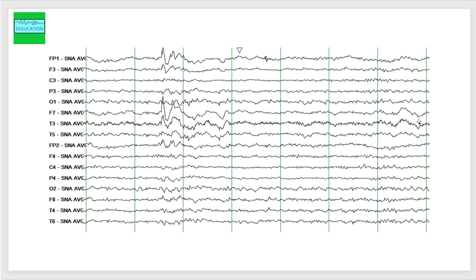When you see asymmetric slowing and sharp waves in one hemisphere, in your EEG report, you can say that this person, these findings are suggestive of a focal disturbance of cerebral function in the left frontotemporal head region, and correlation with neuroimaging is recommended. Since we've seen the sharp waves in the left frontotemporal head region, this person is at a high risk of having seizures from this location.